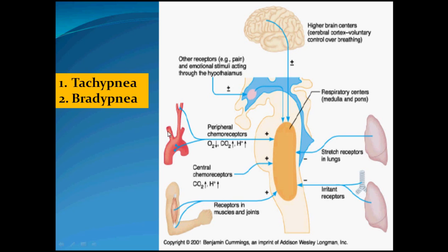Another important point is tachypnea. When there's tachypnea, sometimes it's difficult to control the patients. Keep an eye: don't put the patients on volume controlled ventilation, otherwise they will develop dynamic hyperinflation and pneumothorax. If you put the patients on pressure control, it is a little bit safer. There is no pneumothorax, but you may face hypoventilation and carbon dioxide retention. But this is better than putting the patients on volume control, where they will develop dynamic hyperinflation.